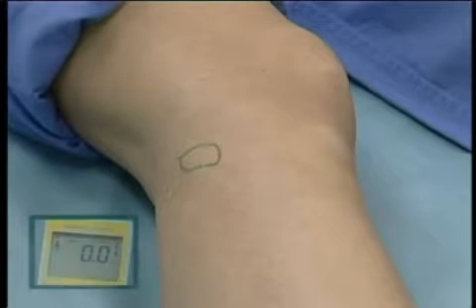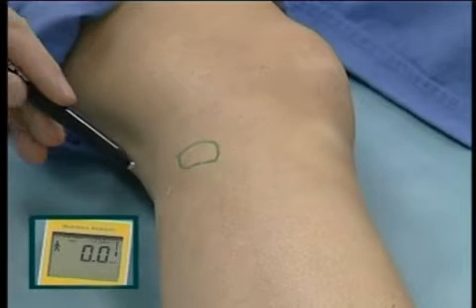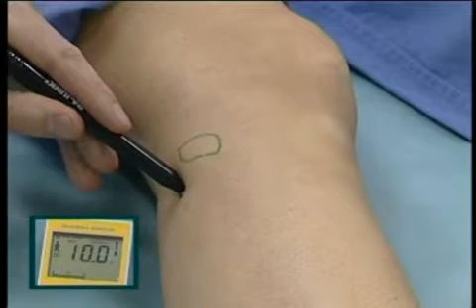Next, we stimulate the common fibular nerve again, lateral to the fibular head, and see mainly eversion of the foot and some dorsiflexion.